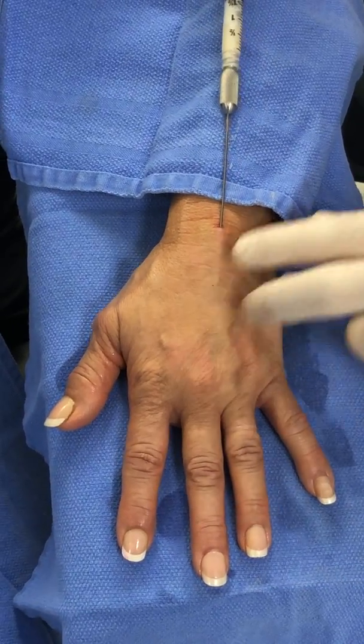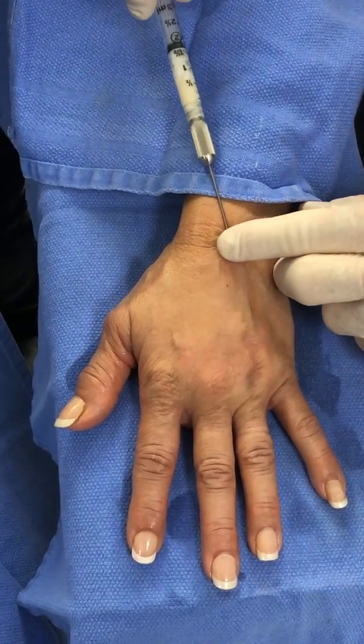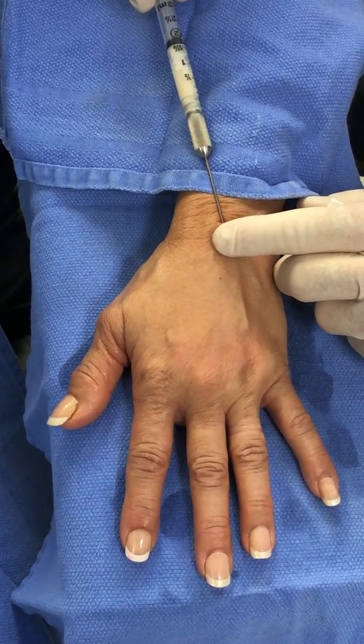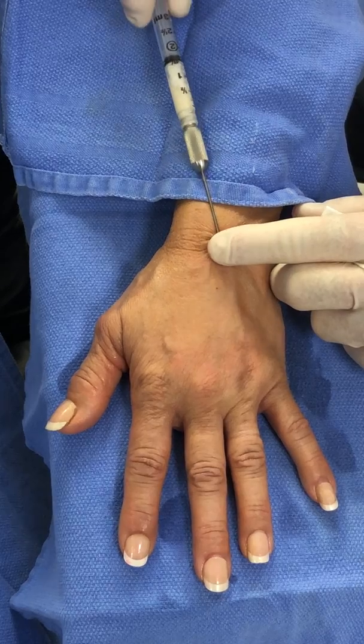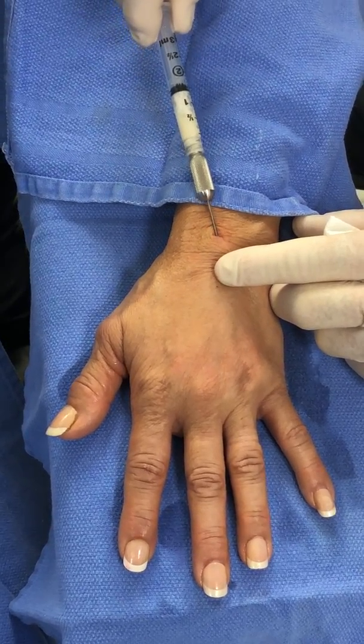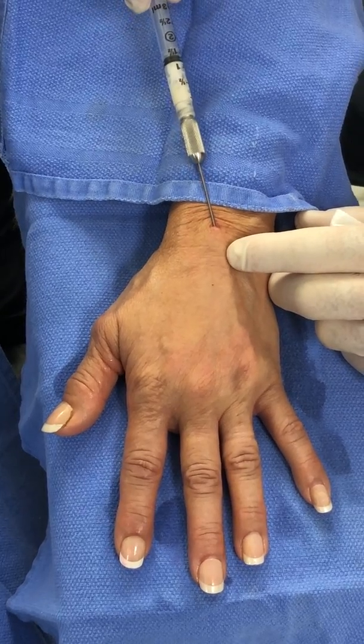Retrograde technique is important. A little trick: if you find a little resistance, you can pre-inject a little bit and that'll create a pathway, and then you can inject retrograde.